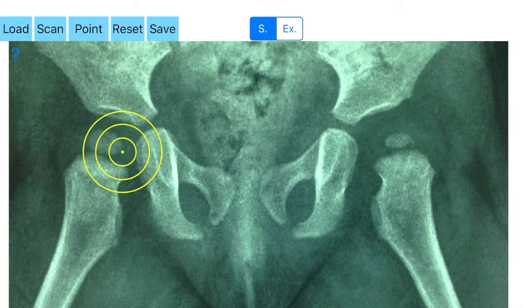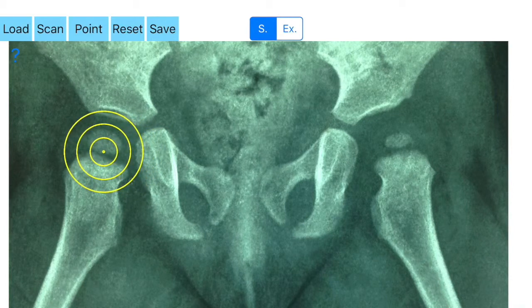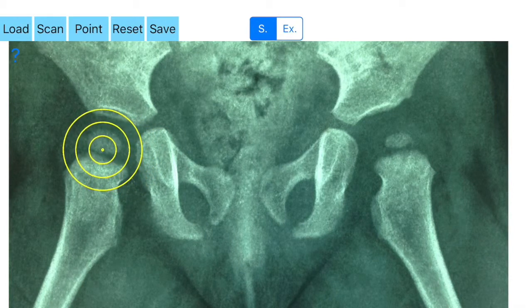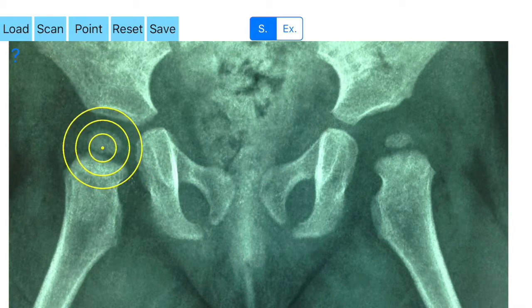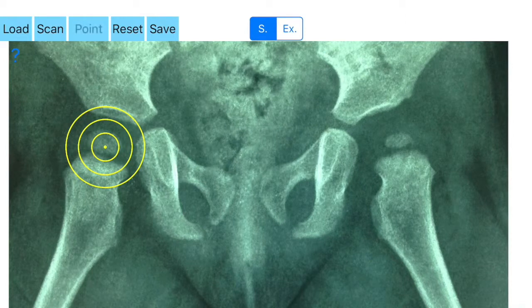First, you aim to locate the center of the femoral head by moving the template over the femoral head, trying to fit a best-fit circle to the contour of the femoral head circumference. Once you find the best-fitted circle superimposed over the femoral head, you click the button option and the center of the femoral head is marked as the first point of measurement.